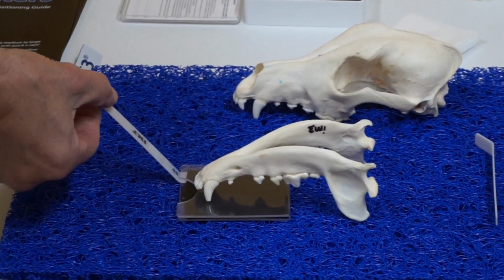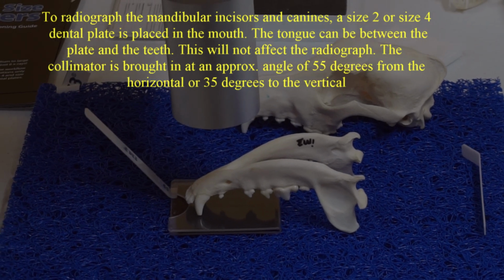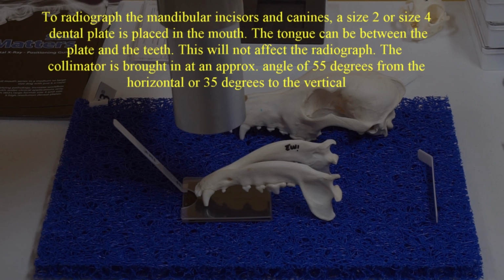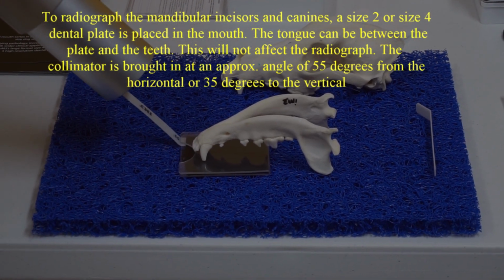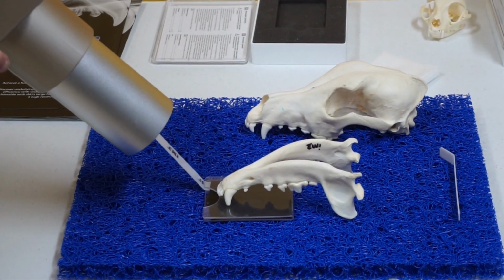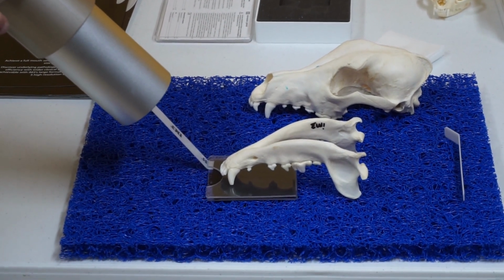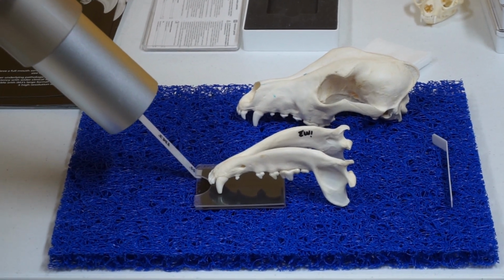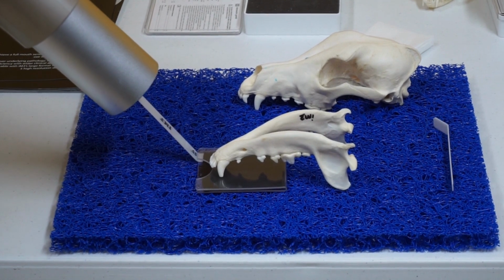We use our angle device here, and basically you can go at right angles to the tabletop and then drop it till it's at around 55 from the horizontal or 35 from the vertical, and by doing that and having it at that sort of length, you shouldn't get any cone cut on your size 4 film, and you can take a view of the incisors and the canines from an anterior-posterior position.